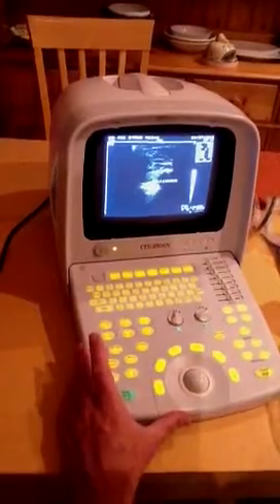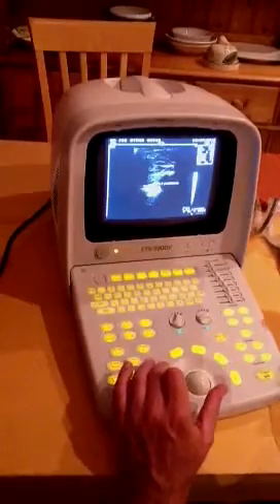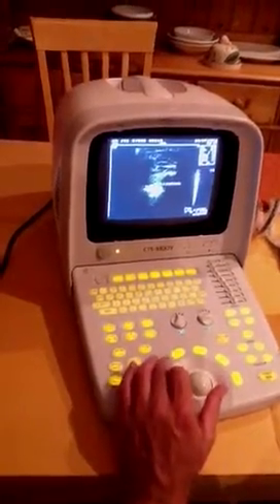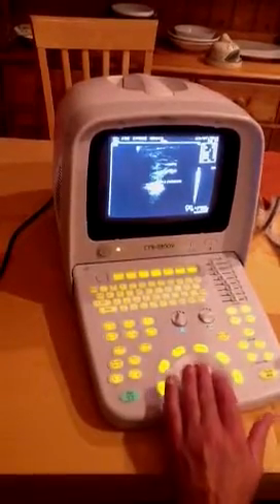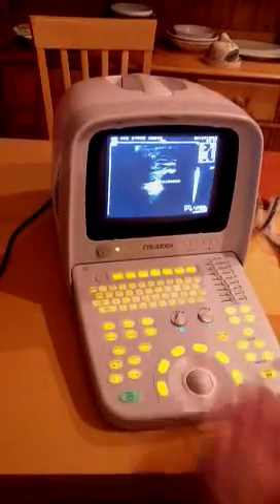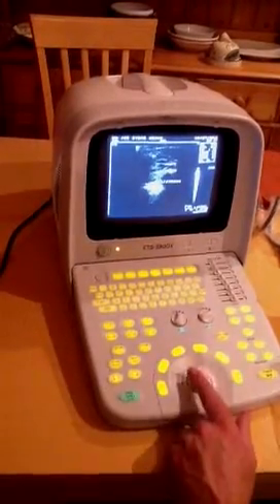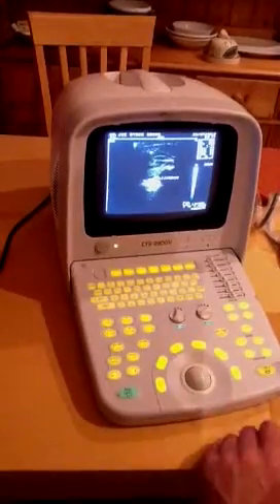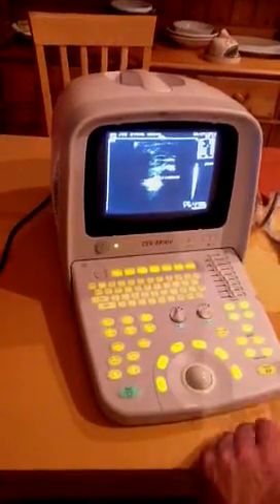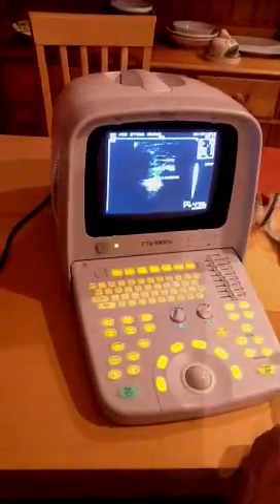There is also a measurement function. You can see the cursor flashing on the screen. You just press enter when the cursor comes on, then move your trackball and it will give you a distance. When you press enter, it will show the distance on the right-hand side — in this case, 23 millimeters.